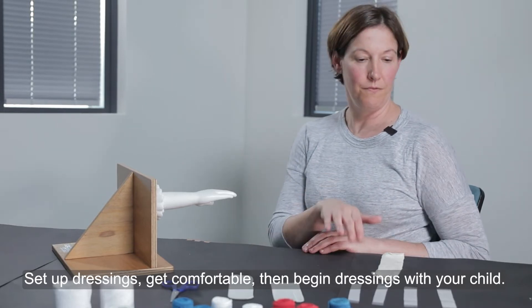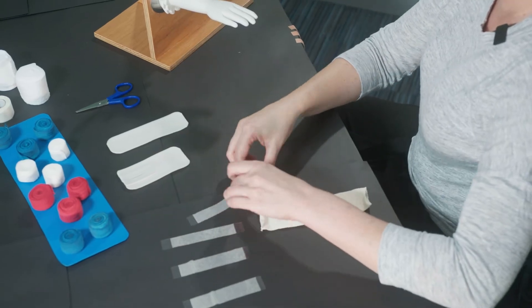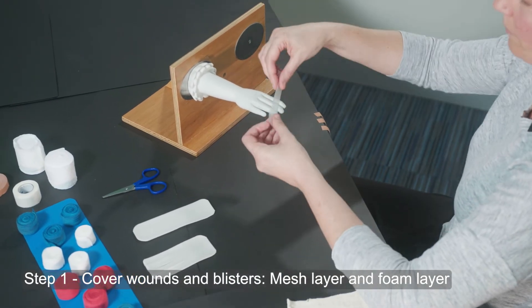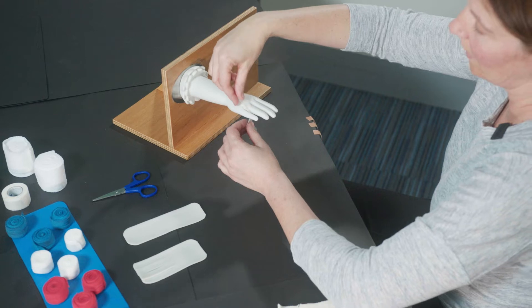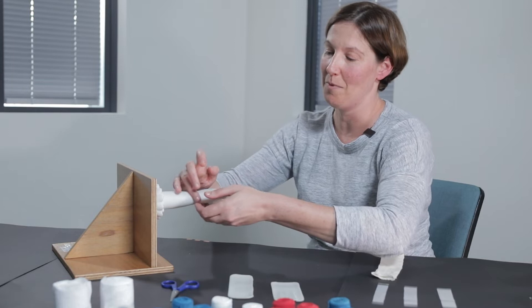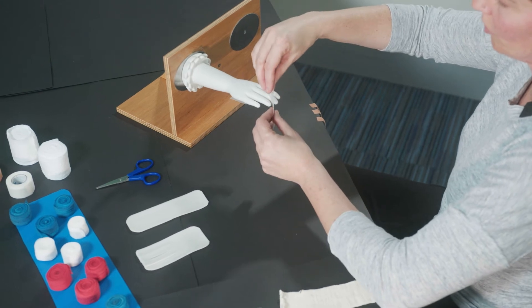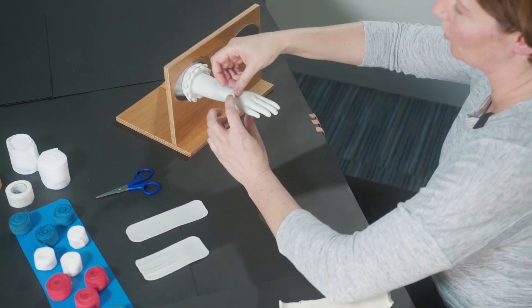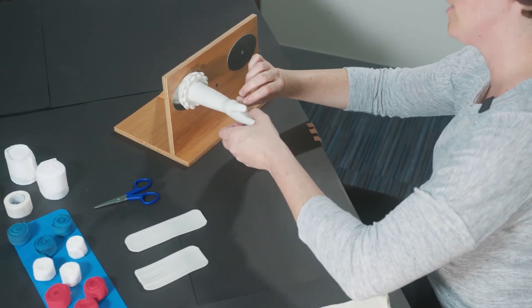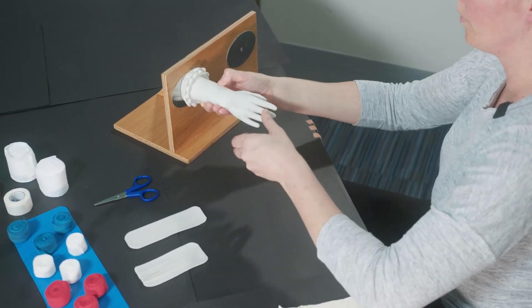Today I'm going to show you the first step of looking after blisters and wounds. We may first use a mesh contact layer — the tops have already been taken off of these which makes it a little bit easier to get started. I'm using a mannequin today, so your child might be a little bit more wiggly. What I'm doing is just gently placing this mesh layer in between each of the web spaces. You'll use as many dressings as you need to cover blisters or wounds on your child's hand.